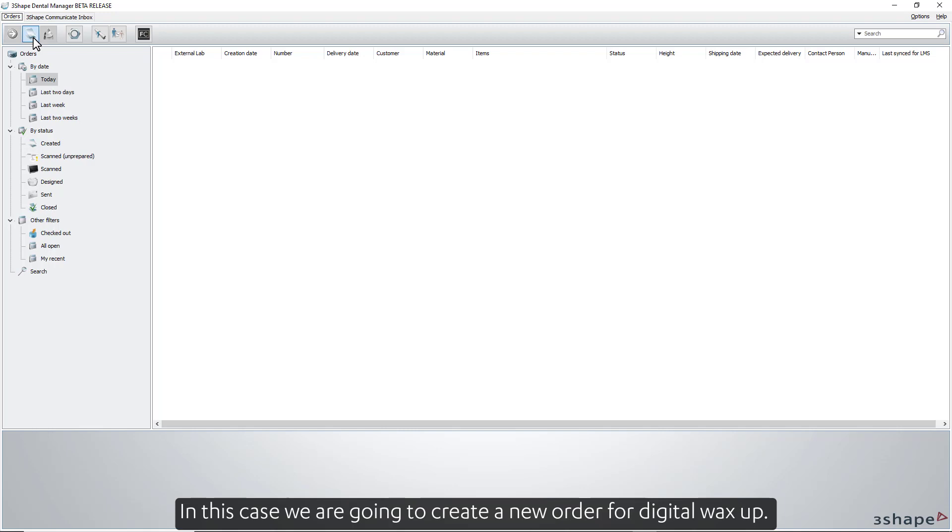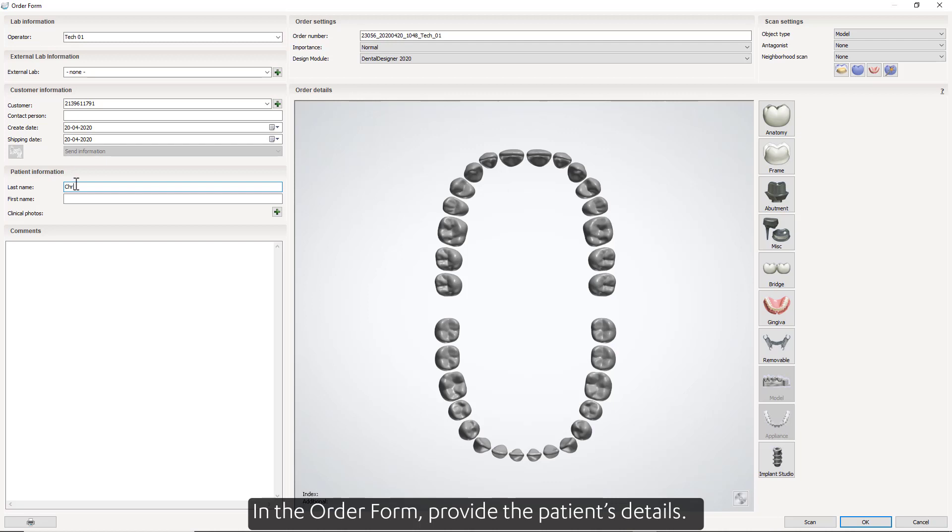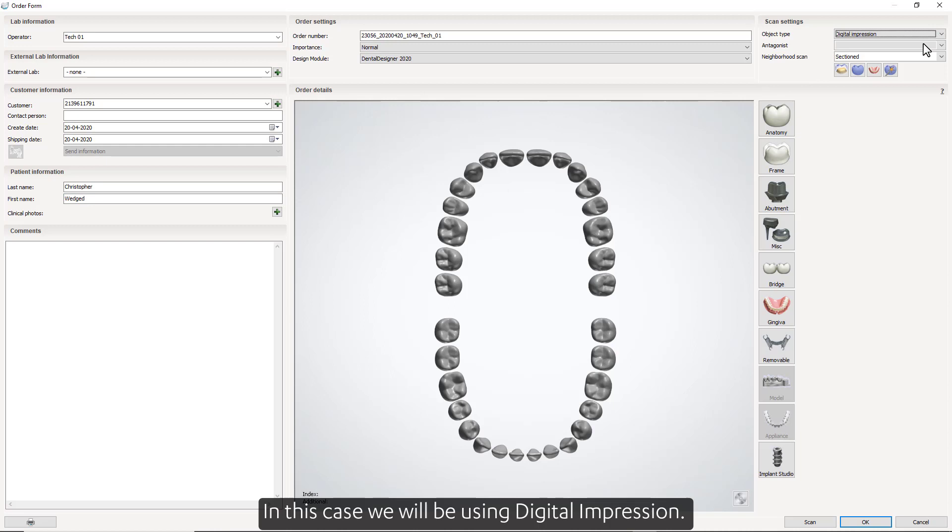Either accept the case in the TRIOS inbox or you can create a new order in 3Shape's Dental Manager. In this case, we're going to create a new order for a digital wax up. In the order form, provide the patient's details. Select your scan settings. In this case, we will be using digital impression.